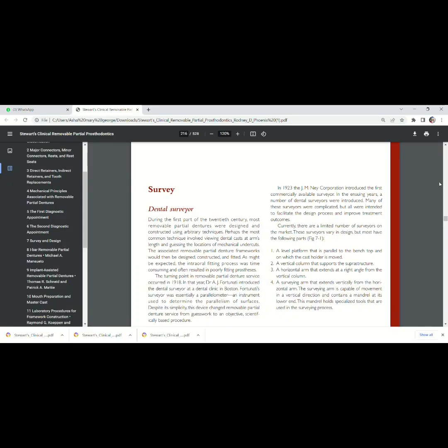First I will be discussing the parts or components of the Dental Surveyor. In 1923, Ney Corporation introduced the Surveyor. Now we will go to different parts of the surveyor.